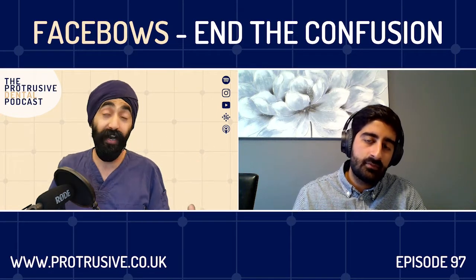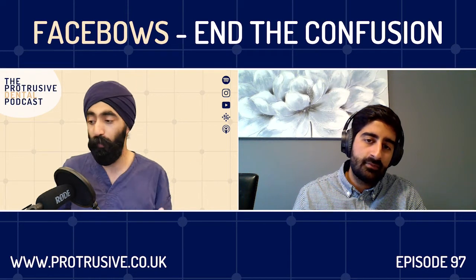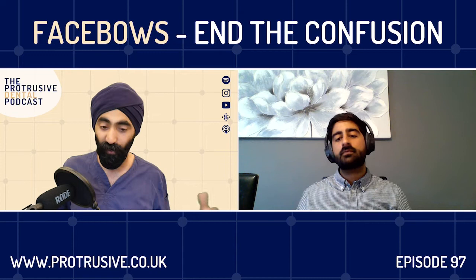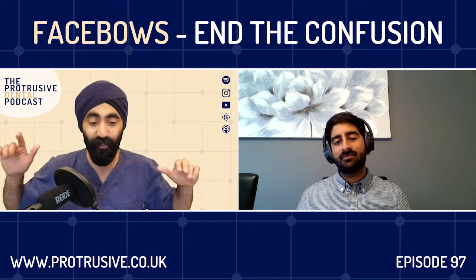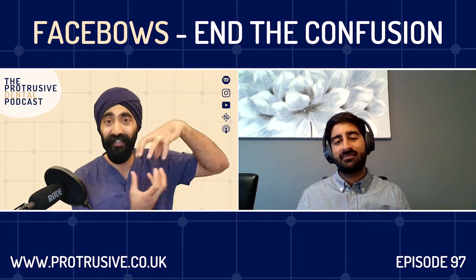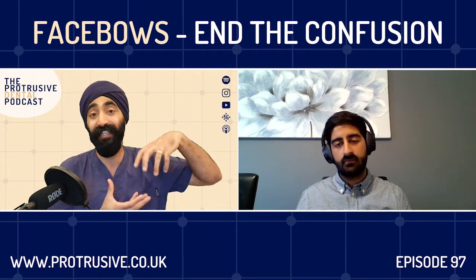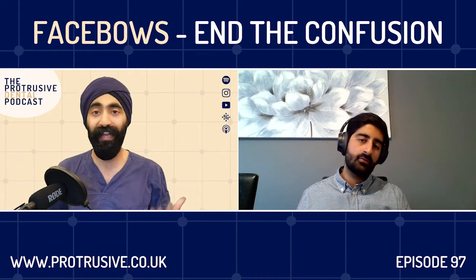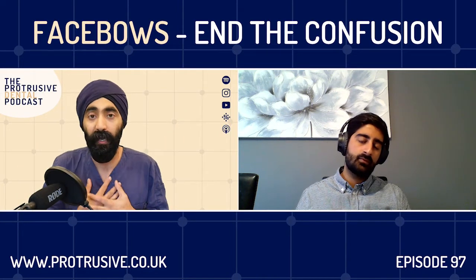But the exciting thing going forward is the Modjaw. People are probably thinking during this episode, okay, who needs a Facebow when you've got a Modjaw? But if you've got a spare 40 grand lying around, I don't know how much it costs, and you want to get their functional chewing patterns and then build those patterns into the restorations, that's the ultimate way to do it, and maybe that's the future. But for now, as a tool for us dentists, there is a place for Facebows.